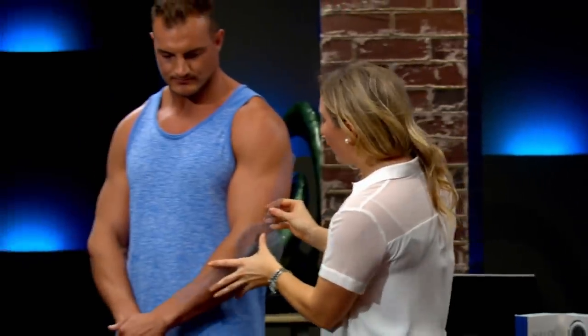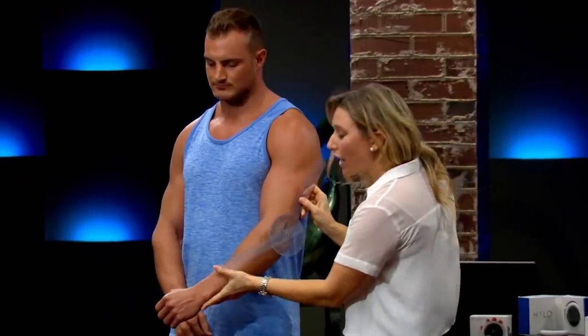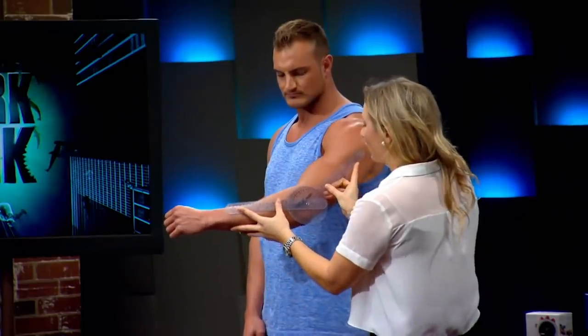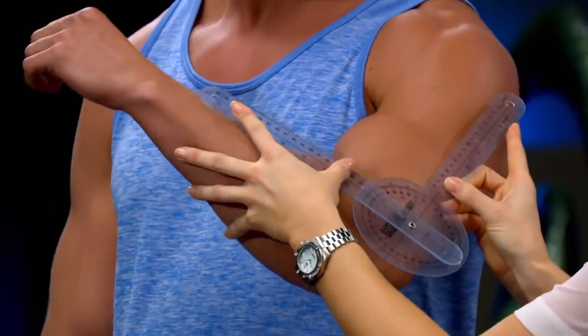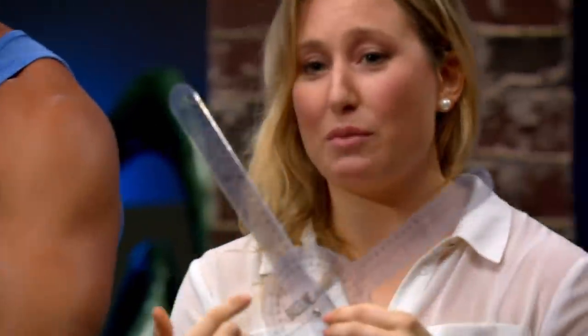So traditionally we'd hold it over, we'd try and make the landmarks up, we'd guess what's happening here. You have to do it with two hands so you can't support the limb. And you're trying to do that because one assumes there's been an injury to the arm and the movement has been restricted. Is that what we're looking at? Exactly. Traditionally, you'd get them to do the range as well. He'd bend his elbow up and then I would have a look what's happening here. So it's very difficult to read the three numbers as well.